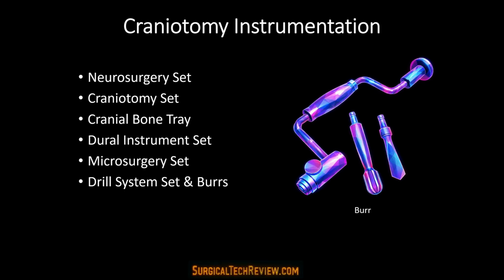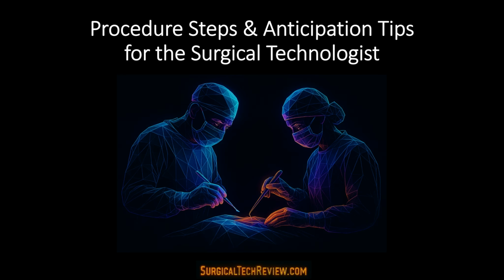Craniotomy cases require multiple specialized instrument sets. These include neurosurgery, craniotomy, cranial bone, dural, and microsurgery sets, along with a drill system, burrs, and a craniotome. The surgical technologist plays a critical role in a craniotomy.